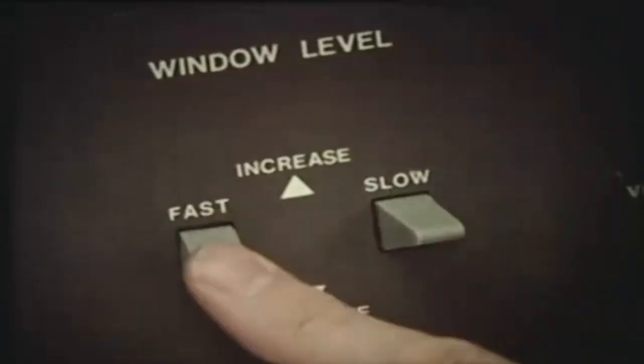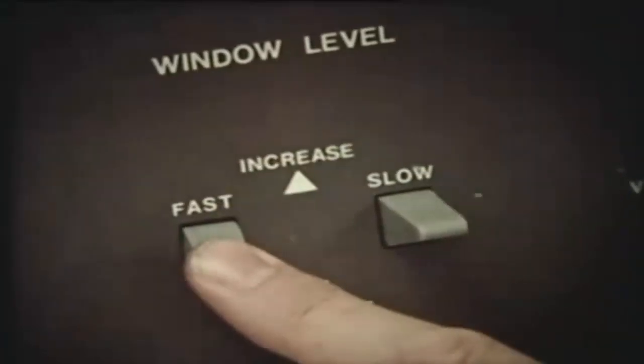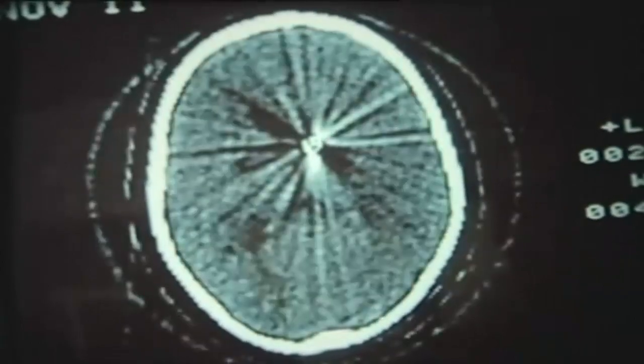We were able to see from the position of this bullet on the scan that, once again, this was not in a life-threatening position, and it was decided that it would be better not to remove this bullet. We recently saw another patient who came into hospital complaining of a pain in the head — it wasn't until after he'd been scanned that it became apparent that he too had a bullet in the head.